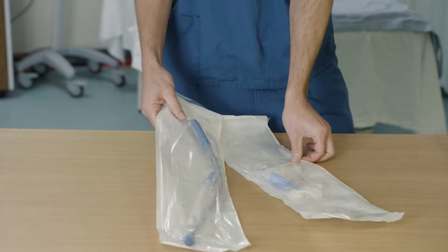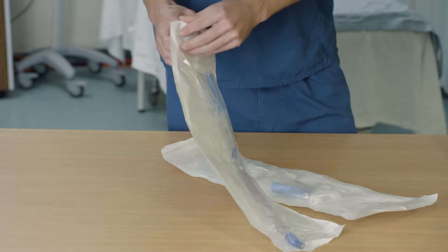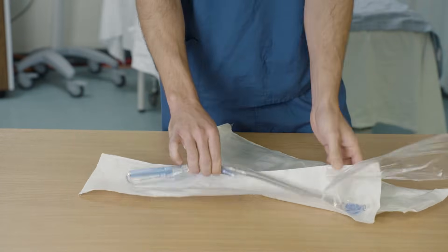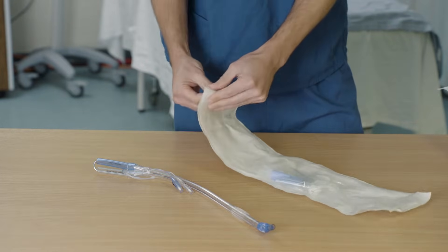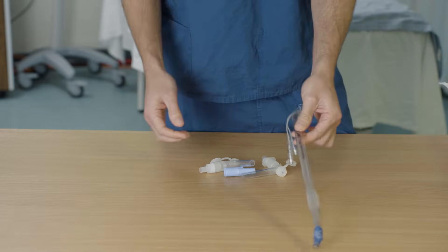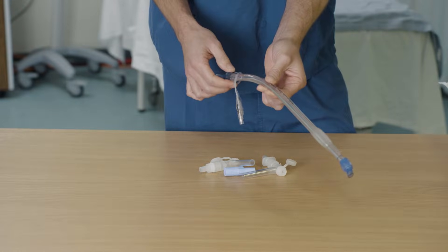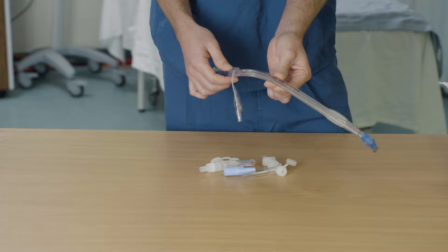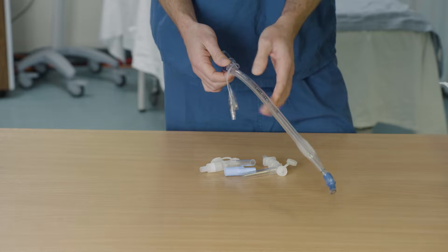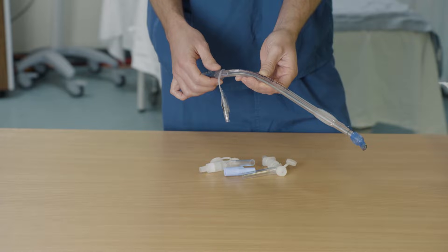Now I'm going to talk you through how to prepare the double lumen tube before you insert it. This is a size 35 double lumen tube — 35 left. We're using a small tube today because we've got to fit it in the mannequin. Generally, you'd use a 37 left for women, a 39 left for men. You might use a 35 like this in a particularly small patient, or a 41 left in a particularly tall patient.